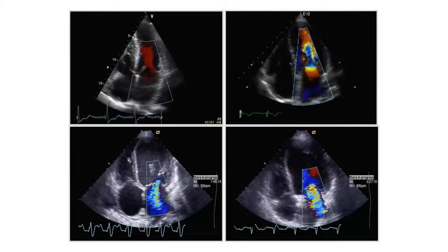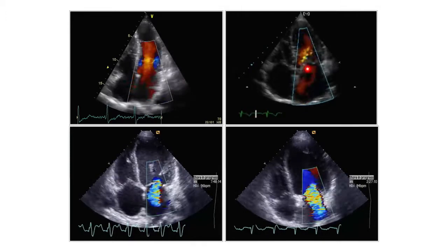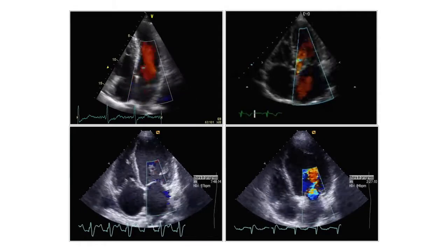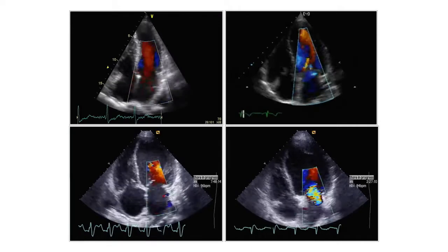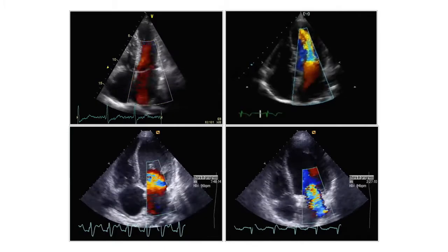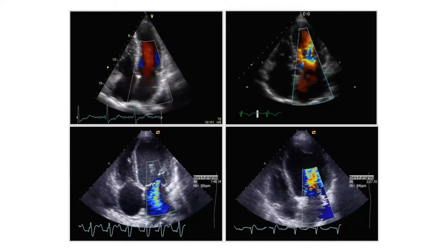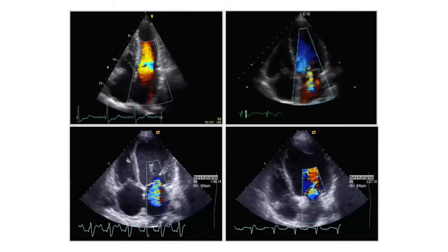And in the second example, actually, we have more MR. You have to concentrate, remember, on the blue part of color, which goes into the left atrium, so away from the transducer. And here we actually can really talk about a more serious degree of MR. But still nothing to be concerned about. It's probably only maybe mild to moderate, but more towards mild, I would say.